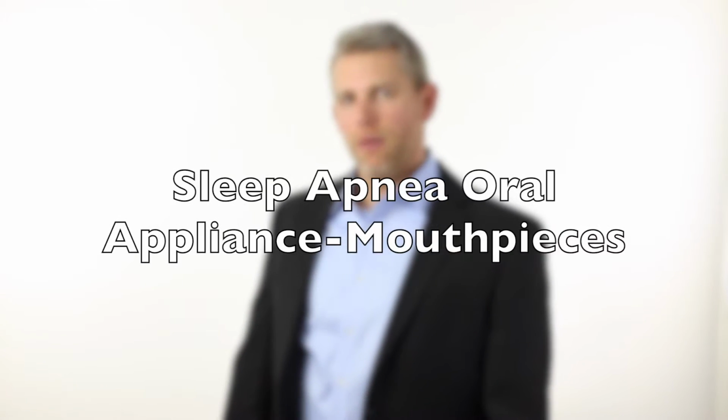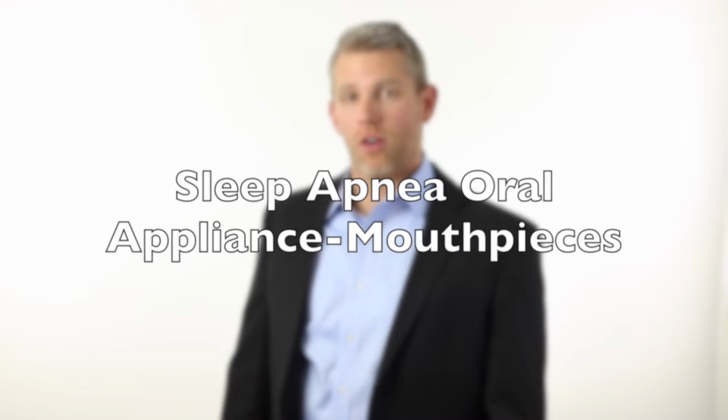So there are multiple treatments for sleep apnea, obstructive sleep apnea. One of the most important ones would be CPAP. It's kind of the gold standard. Surgery is another option, but the most important thing that I do at my office is what's called oral appliance therapy. Some people will call this a mouthpiece or a mouth guard. Basically, it's a way of keeping the jaw supported so it doesn't fall backward and close off the airway.